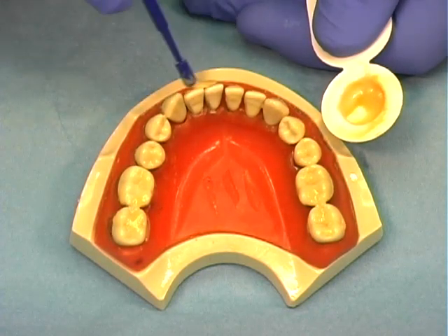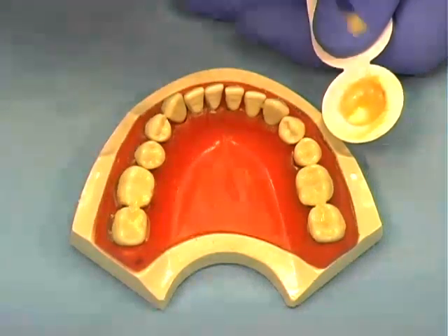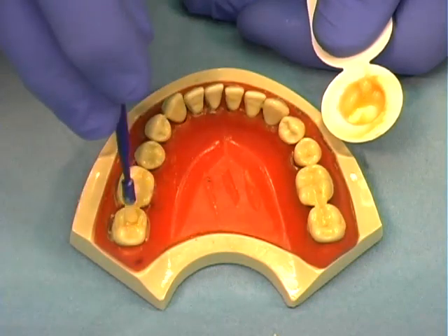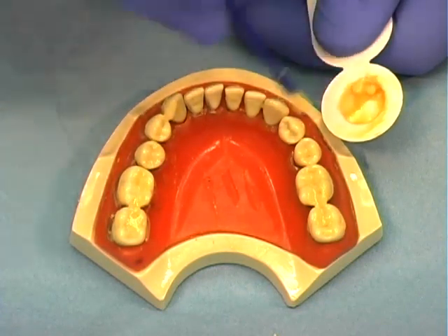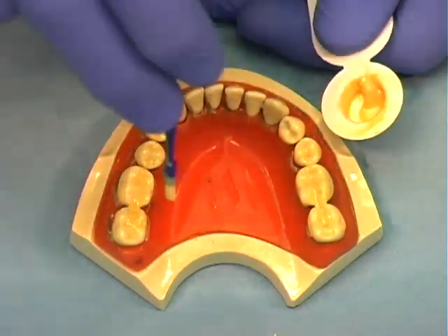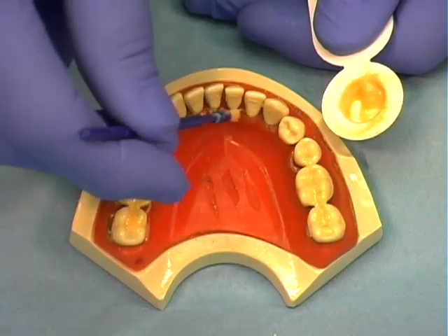Starting with the mandibular teeth, apply the varnish on the facial, occlusal, then lingual surfaces, and repeat on the maxillary teeth. Make sure to provide full coverage to all areas of the teeth, including areas of recession. The application time is approximately 1 to 3 minutes for both arches.